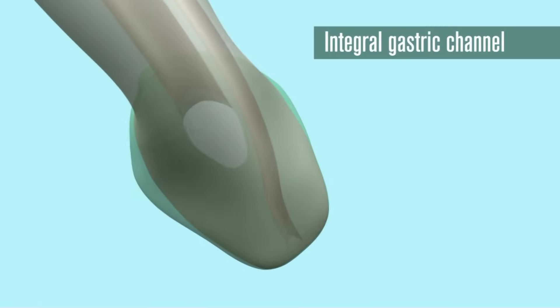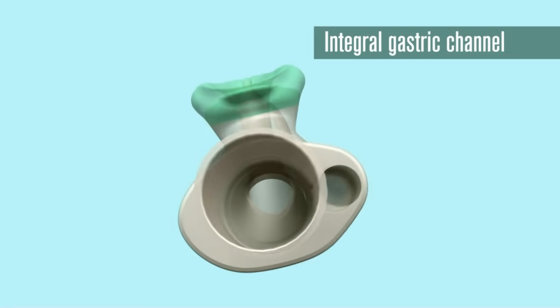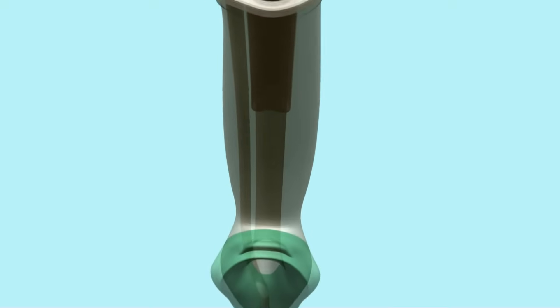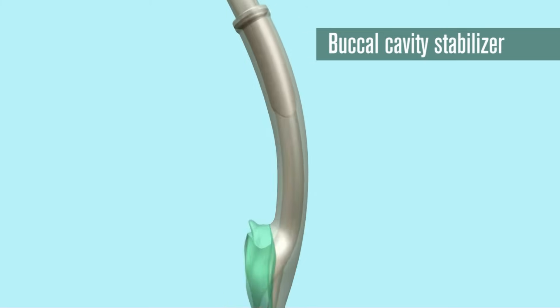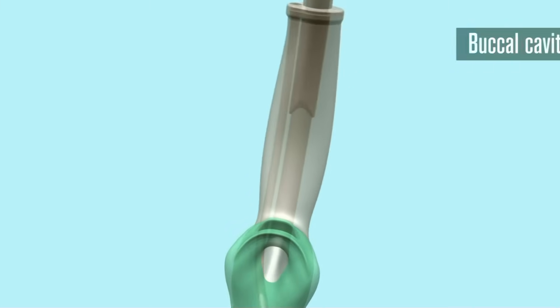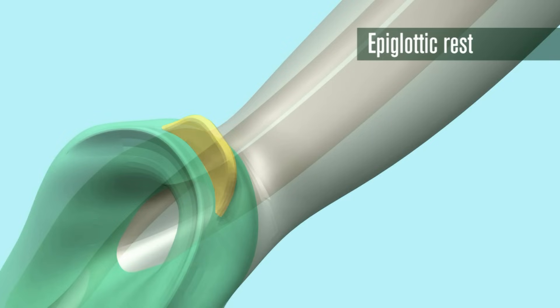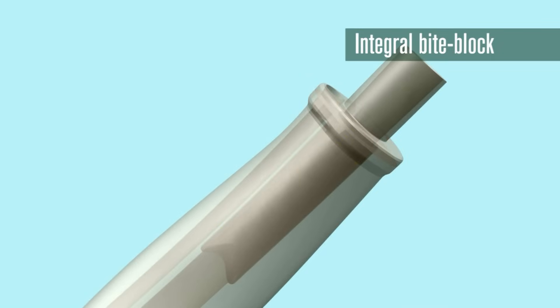An integral gastric channel is provided to reduce the risk of aspiration and allow for passing of a nasogastric tube. The buccal cavity stabiliser eliminates the potential for rotation and aids insertion. An epiglottis blocker helps to prevent the epiglottis from down-folding or obstructing the distal opening of the airway. The 15mm connector extends inside the airway tube far enough to provide an integral bite block.